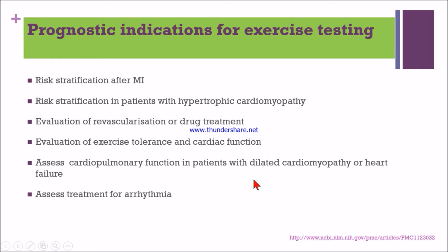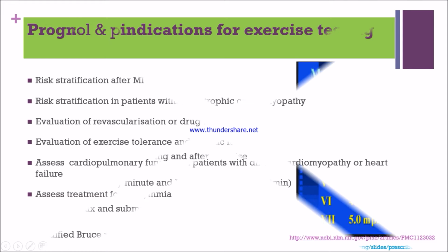In patients with dilated cardiomyopathy or congestive cardiac failure, we use the exercise ECG testing to see the prognosis of that patient. Especially to detect arrhythmia, we use the exercise ECG testing. So these are all the prognostic indications for exercise ECG testing.